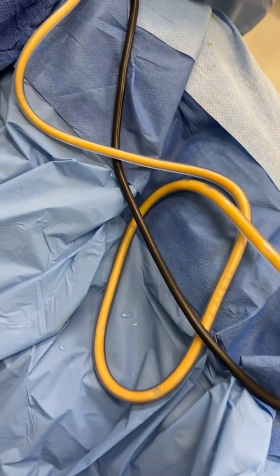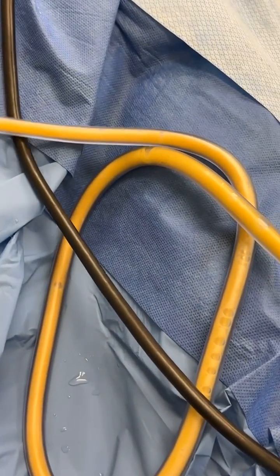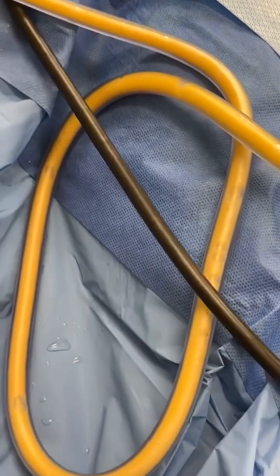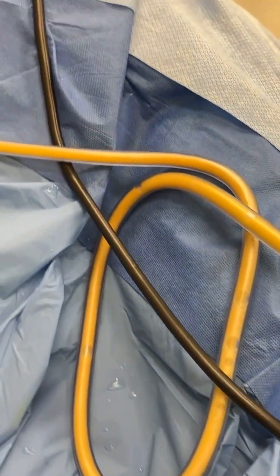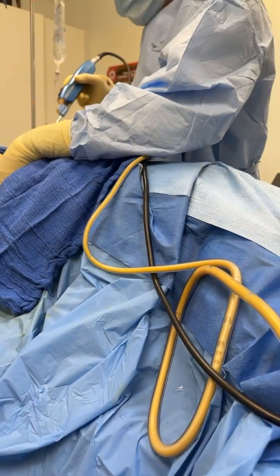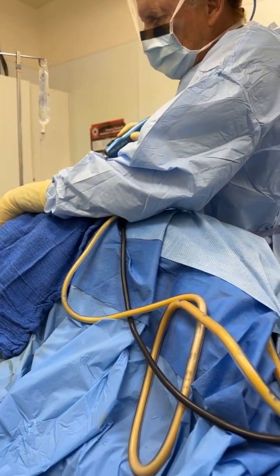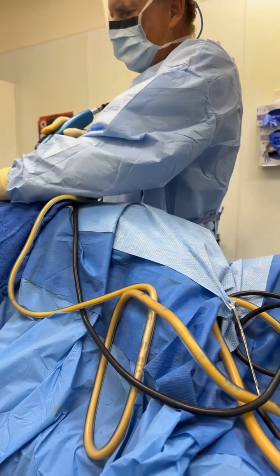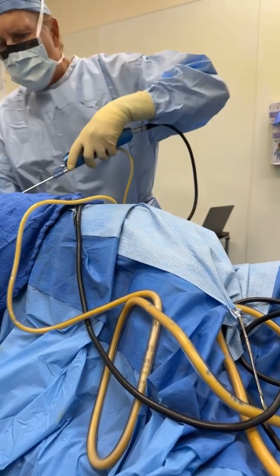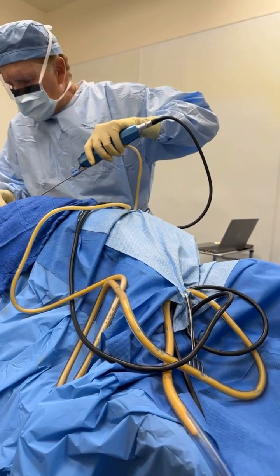It's like driving a car. If you go very fast, you're going to lose control of the vehicle and go into an unintended area and perforate an organ, something that we have never done here, and never had anybody die, thanks to God, and we're going to keep it that way, right? But what happens is that when you go slow like this, and you switch hands, see, I'm switching hands again, right?